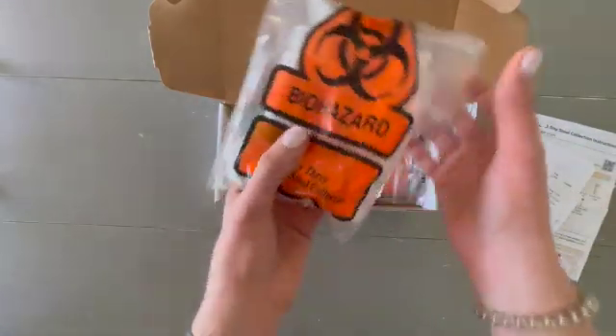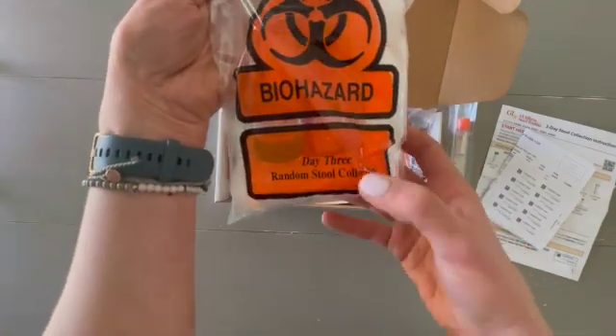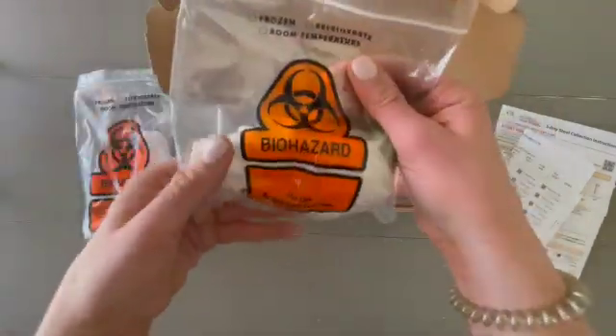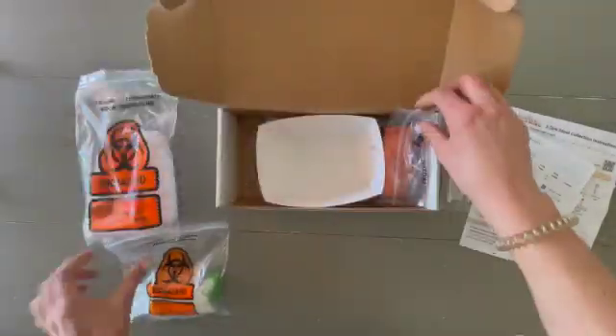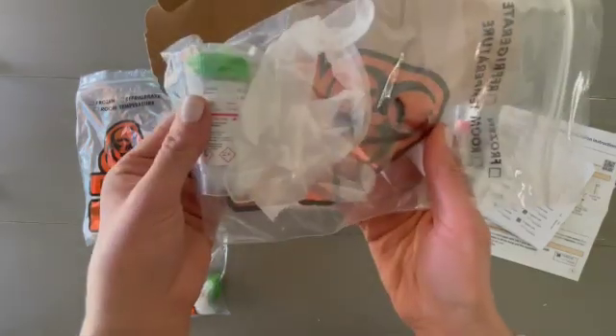The stool test is divided into three days. Each biohazard bag will tell you what day it is. Here's day three — it's going to be the largest collection. Day one and day two will look very similar, with just one vial inside, and day two again has that green top.